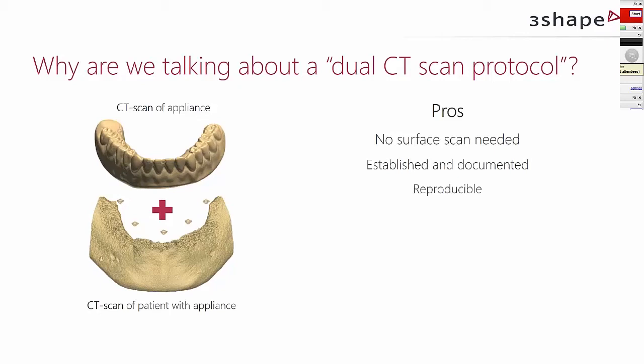It's easily reproducible. It's prosthetic driven, since we have the ability to use an existing denture or setup in the workflow and use that for implant planning. And it's very easy to get from appliance to actual guide, and the turnover there doesn't require a lot of software skills. So that's some of the pros.